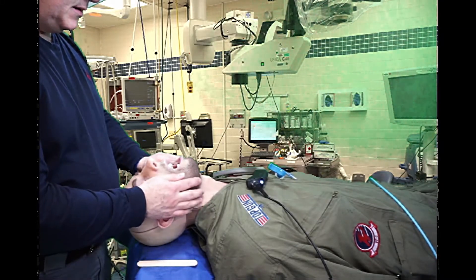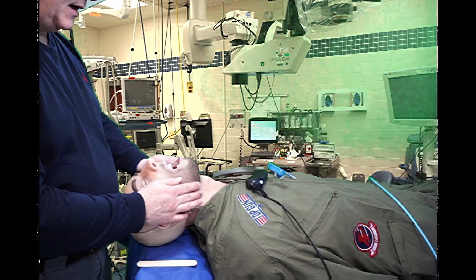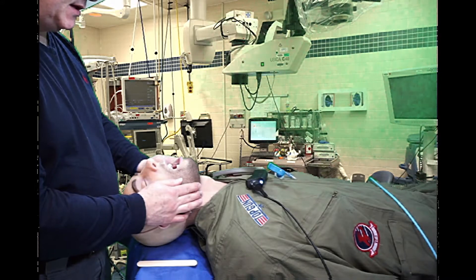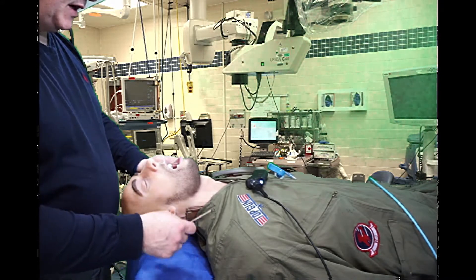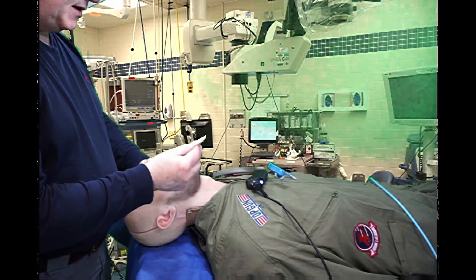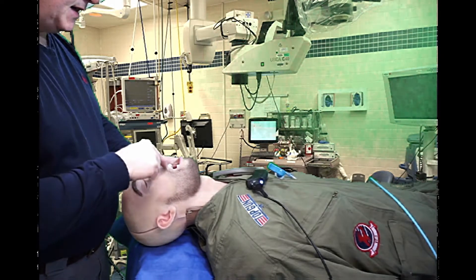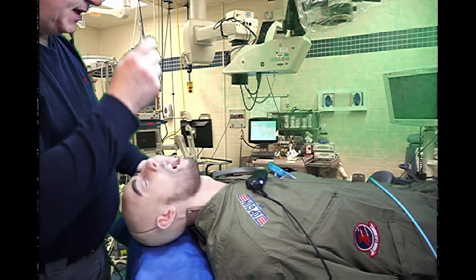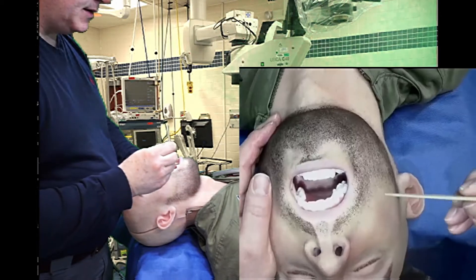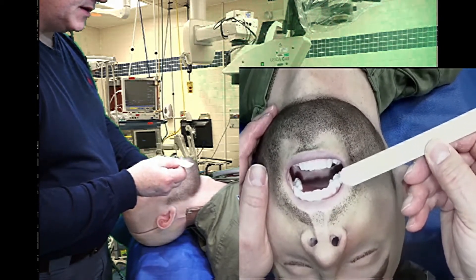I've got the Seven Sigma standard airway in this mannequin and I'm going to demonstrate the suite of the micro skills. The suite of the micro skills consists of the tongue depressor assisted scissor maneuver, the salad pinch, and the salad poke. We'll begin with the tongue depressor assisted scissor maneuver.